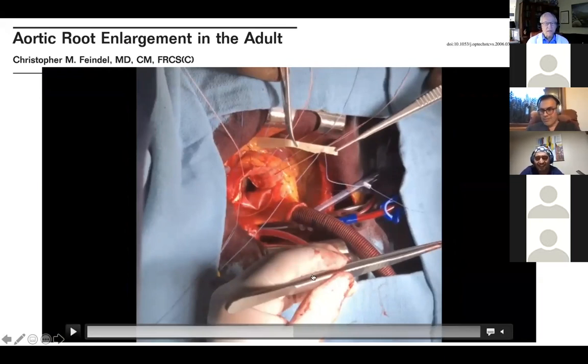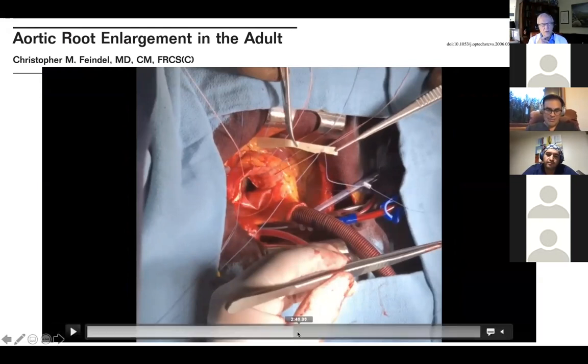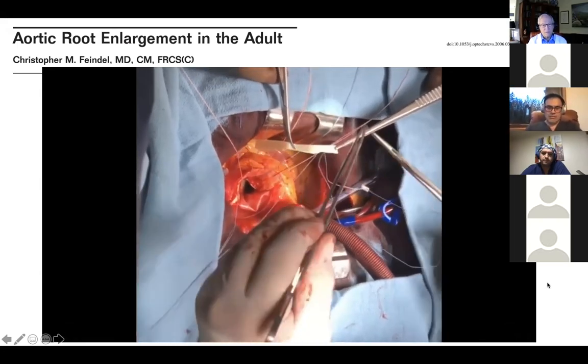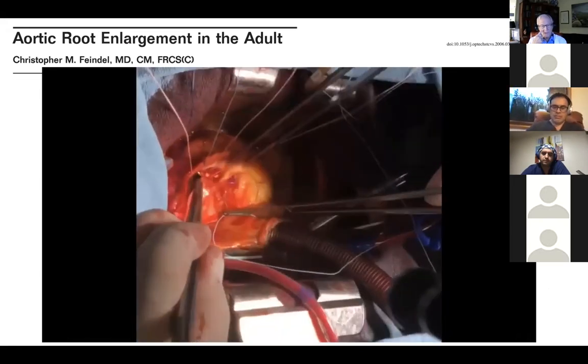No, the only thing is, in this particular video, we didn't actually cut across the aortic annulus, but you could do that, especially for a small annulus, you may have to do that. So this way allows the valve to be inserted above the annulus, which usually gives you one more size. But if you cut across into the mitral valve, you could probably get even a bigger size.